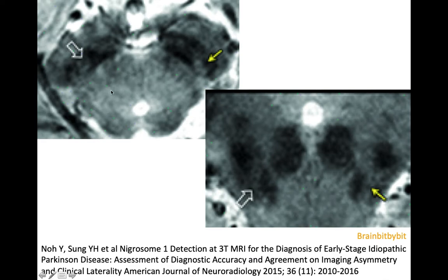In Parkinson's disease there is loss of the swallowtail sign. These are 3 tesla images used in clinical practice. On the right side, in this patient with Parkinson's disease, there is complete loss of the swallowtail. On the left side, the swallowtail is abnormal because the nigrosome appears smaller — this corresponded to the clinical symptoms, as the motor score on the right side was 1 and on the left side was 4.